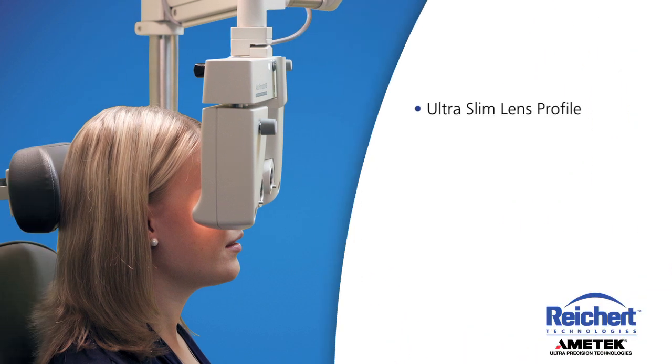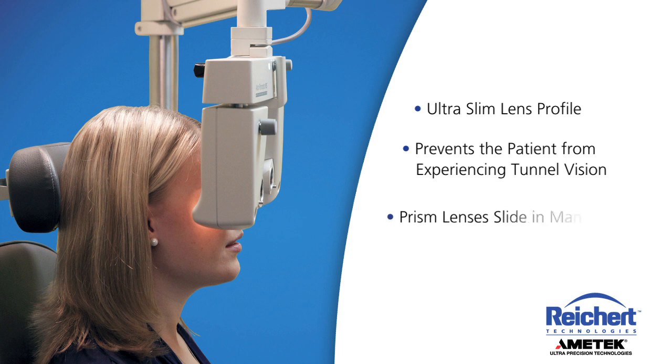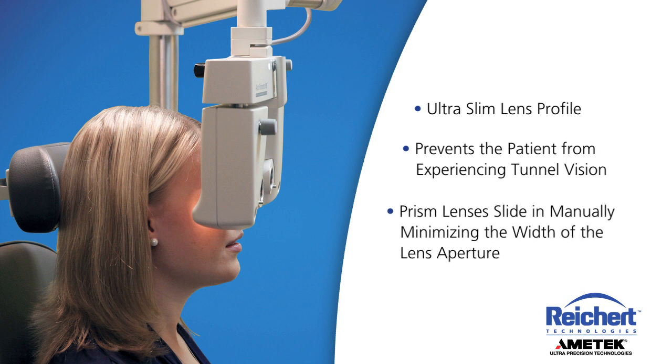The Ultra Slim Lens Profile helps prevent the patient from experiencing tunnel vision. Prism lenses slide in manually when needed, minimizing the width of the lens aperture.